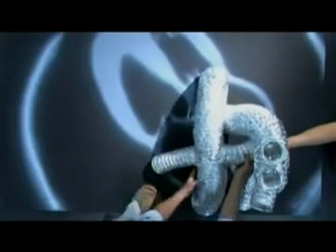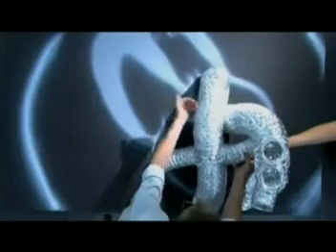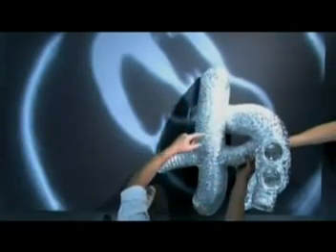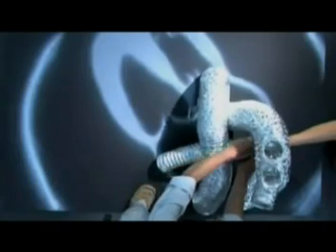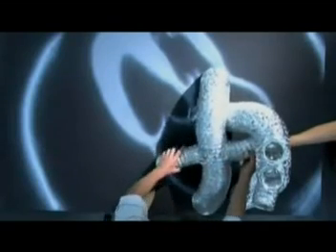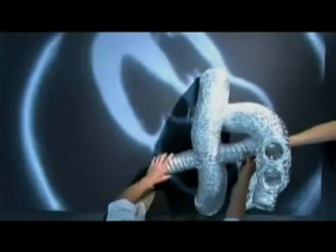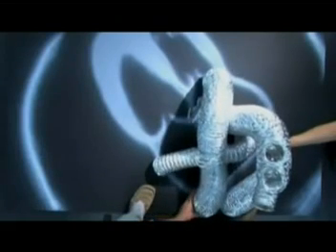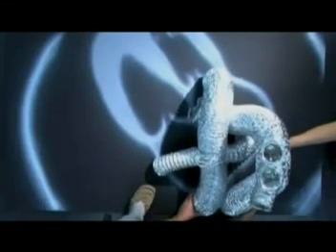So you end up with aorta going up, over and down, pulmonary coming more or less straight back, right branch curling round the ascending aorta, left branch going off into the left lung field. They're both heading down to the same place, where the descending aorta goes.